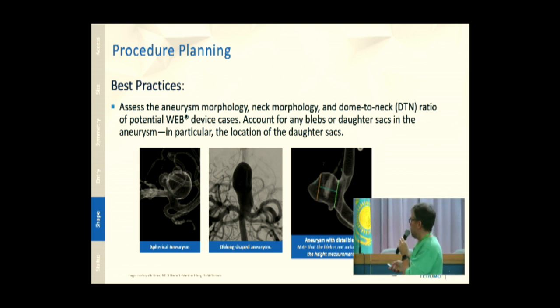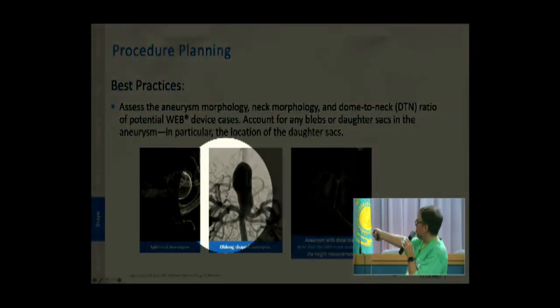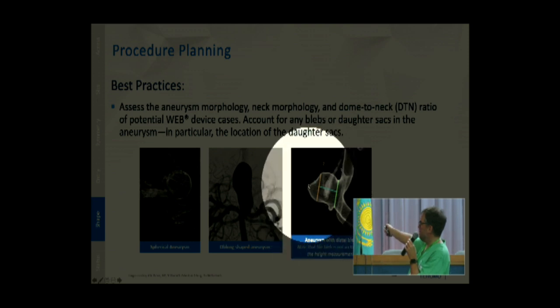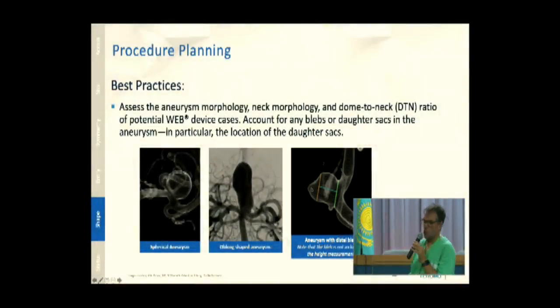and you always have to take that into consideration. An interesting case is also this one, because it shows you something. When you measure the height, don't be aggressive. Don't measure the height where the web is not going to go. For example, if you think about the shape the web has, it's never going to reach that cap, so don't measure that height when taking the web into consideration.